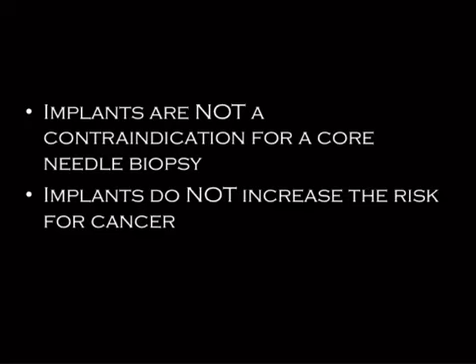So here's some quick rapid review on implants, some testable trivia. First, implants are not a contraindication for core-needle biopsy. You can still biopsy the breast even if they have implants. You just have to pay attention to what you're doing. Yes, you can puncture an implant with a biopsy needle. Even with an FNA needle, you could potentially deflate a saline implant if you don't know what you're doing. But it's not a contraindication.